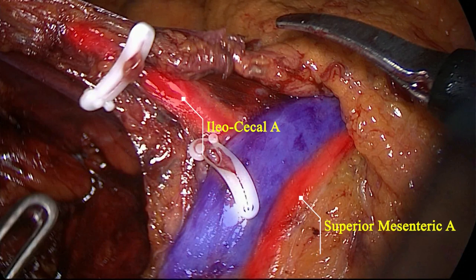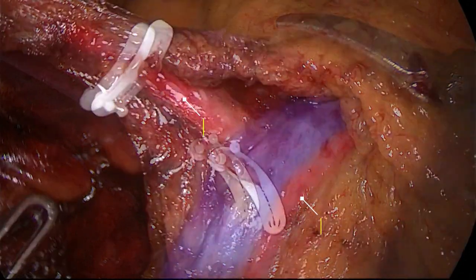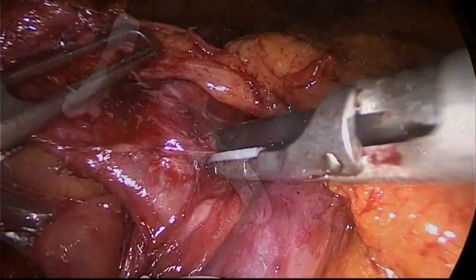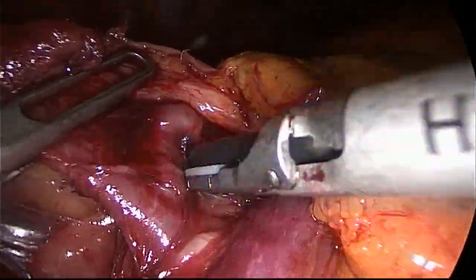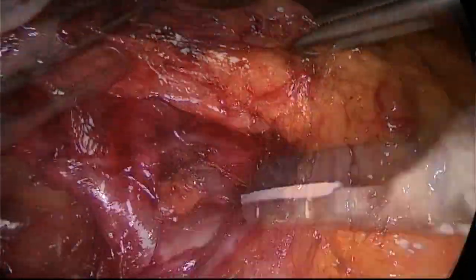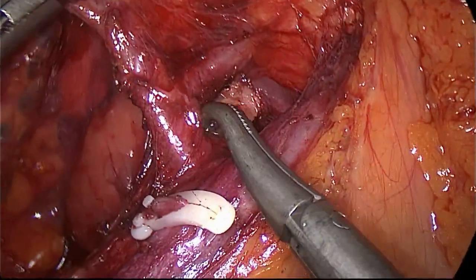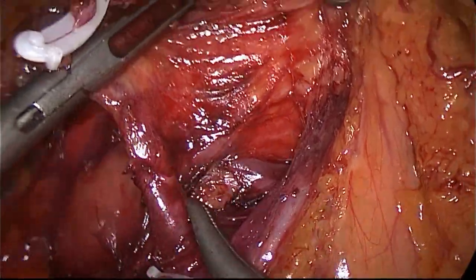The confluence of the ileocolic vein is dissected free and sectioned between hemoclips. We continue harvesting all lymphatic tissue from the anterior side of the superior mesenteric vein until we identify the ileocolic artery. From the ileocolic artery, we see that a right colic artery emerges, and the vessel is clipped at its origin laterally to the SMV border.